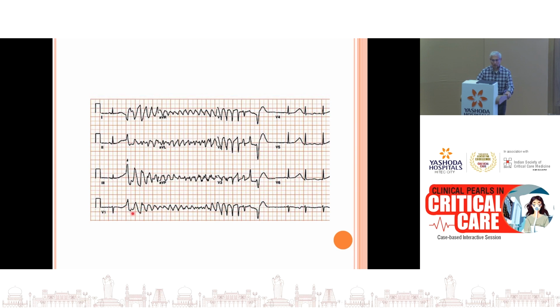But what kind of ventricular tachycardia is this? If you look at the shape and the direction of the QRS, it is changing, widely varying. So this is called a polymorphic ventricular tachycardia. And because you can see the QT interval here is prolonged, this kind of polymorphic ventricular tachycardia is called torsade de pointes. It's a French term, meaning rotation of points.